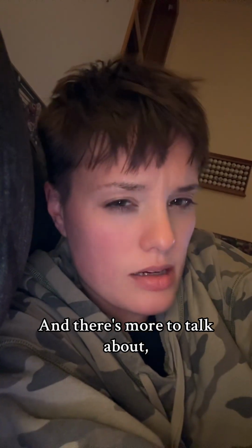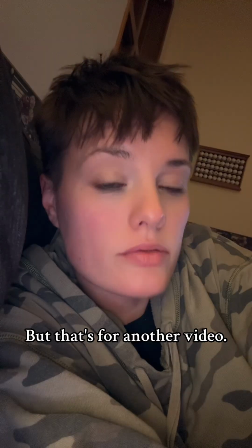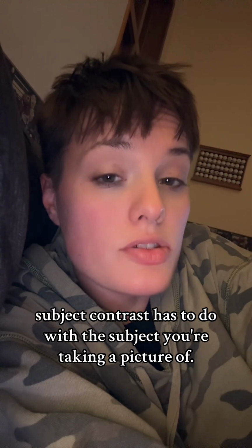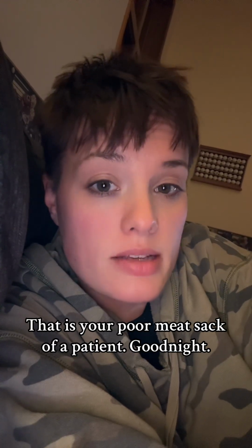And there's more to talk about like pathology and stuff like that, but that's for another video. Most important thing, remember, subject contrast has to do with the subject you're taking a picture of. That is your poor meat sack of a patient.